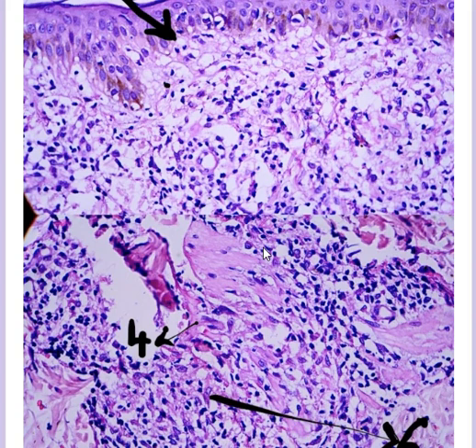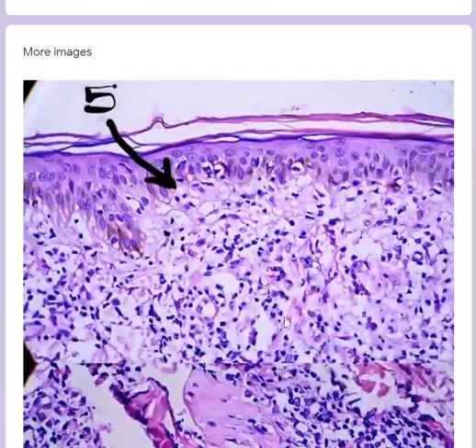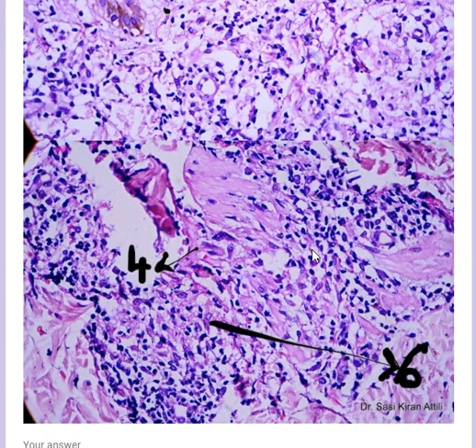Now, if you had come to the workshop we organized in Vijayawada a few weeks ago, you would have learned that infiltration of arrector pili muscle is quite specific for the diagnosis of Hansen's disease, and that is what the diagnosis is here today. This is borderline in the tuberculoid spectrum, borderline tuberculoid Hansen's. Okay. Of course, infiltration of nerves and perieccrine infiltrates are also seen in Hansen's, though they're not very specific. You can see them in other conditions, but perieccrine infiltrates, peripilar infiltrates, especially when the muscle cell is destroyed, is fairly specific to the diagnosis of Hansen's.